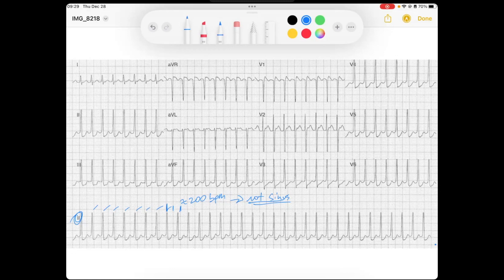I've got this narrow QRS and it's very regular. You need to make sure it's regular. If you have a pair of calipers, you can measure out and see that all these RR intervals are the same — so it is regular.